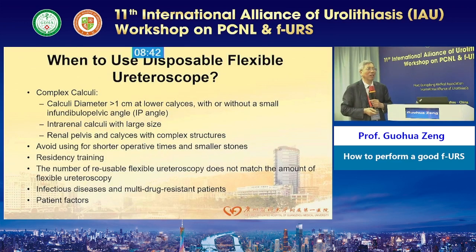Okay, when you use a disposable flexible ureteroscope, how many people use disposable now? Oh, too many. Actually, in our department, I have reusable and single use, half and half, because if you always use single use, maybe it increases cost.